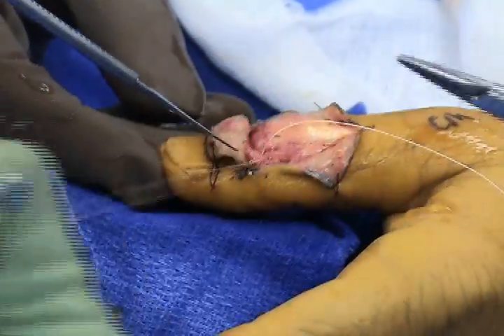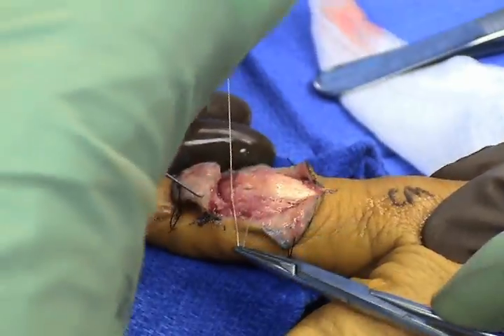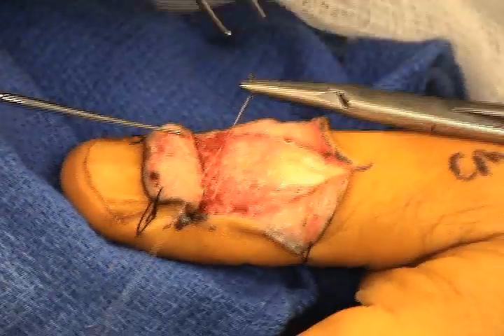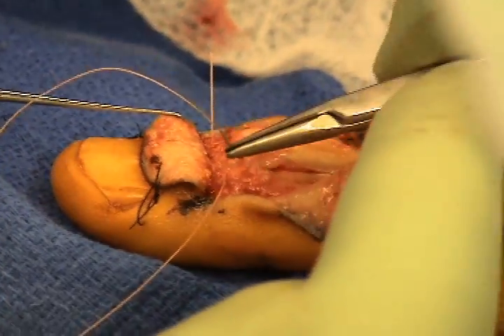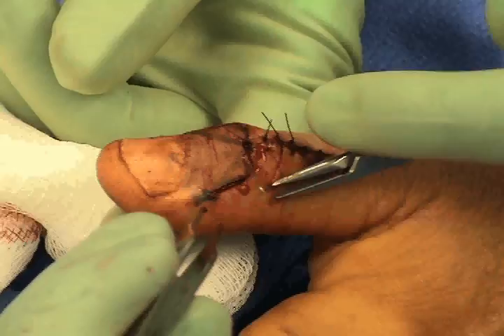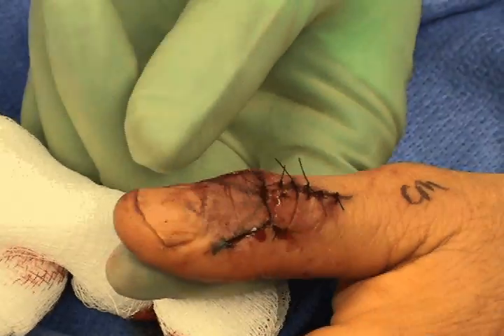Additional sutures are used to help reinforce the distal attachment of the EPL tendon. The patient can then be mobilized after the wounds are closed with dynamic splinting, allowing active flexion and dynamic extension. The wounds are closed with interrupted sutures as demonstrated here.